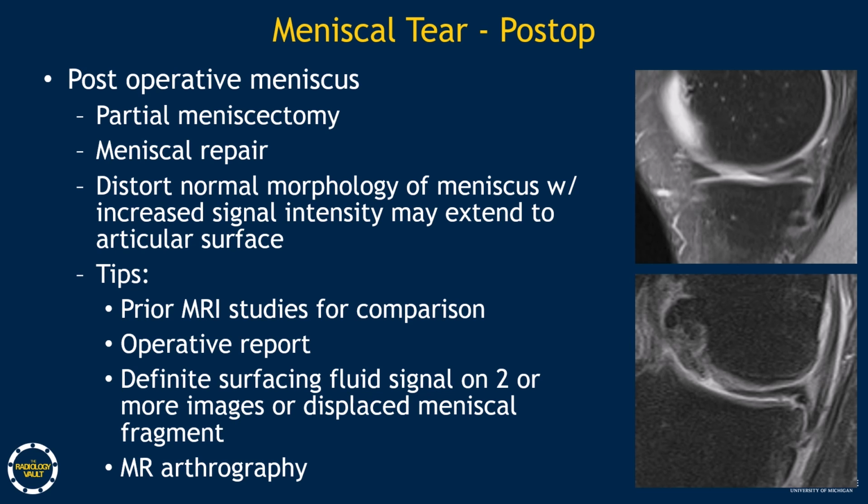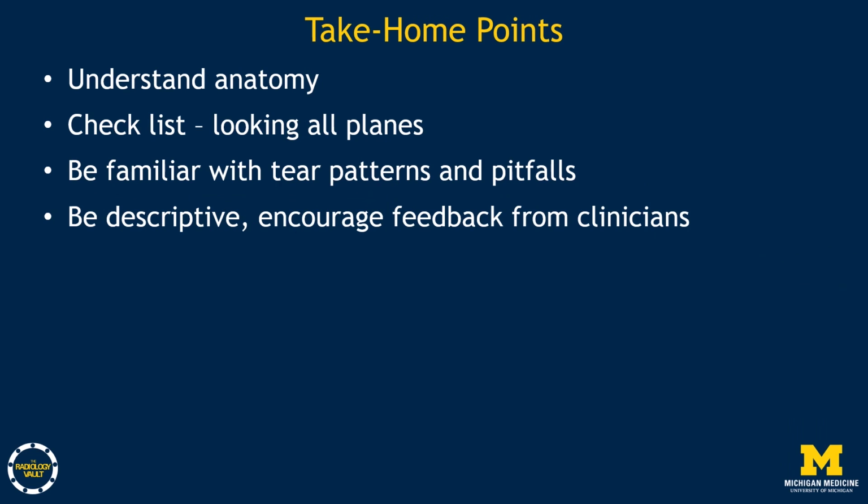Okay, in summary, understand anatomy, making your own checklist. Look at all planes. Be familiar with tear patterns and pitfalls. When reporting, be descriptive. Encourage feedback from clinical colleagues.